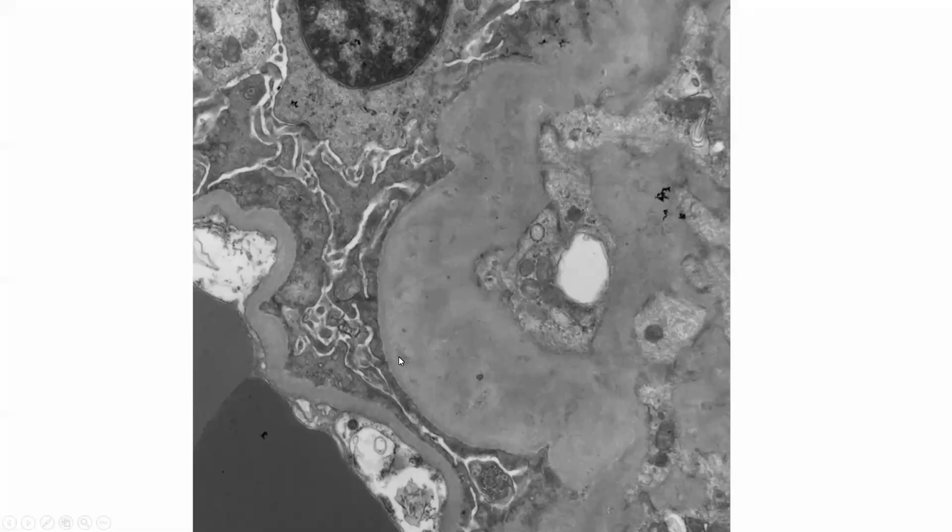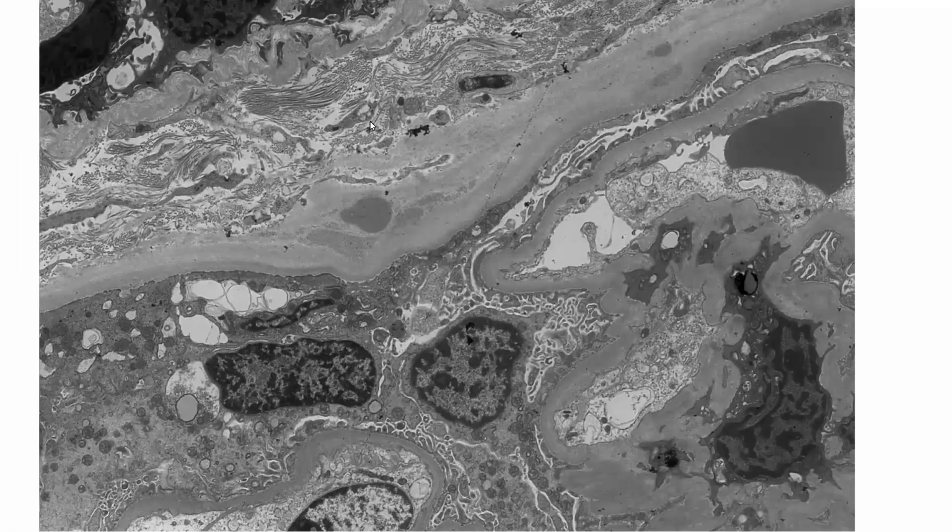So we were worried about this patient. And we were worried about the C3 staining and not sure what to do with it, and not sure how to determine whether it was specific to a recurrence of her disease or just non-specific C3 staining. Oh yeah, we also saw a little bit of electron dense material out in Bowman's capsule.